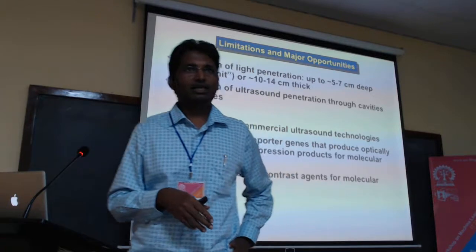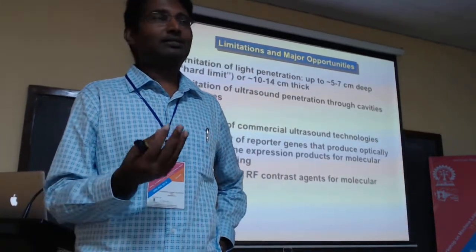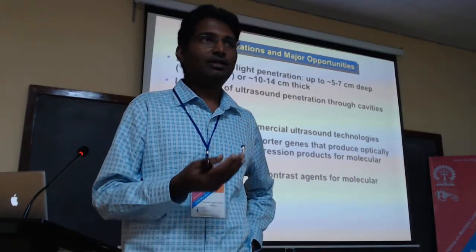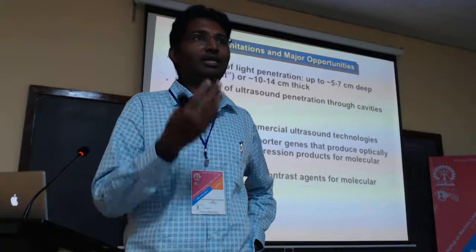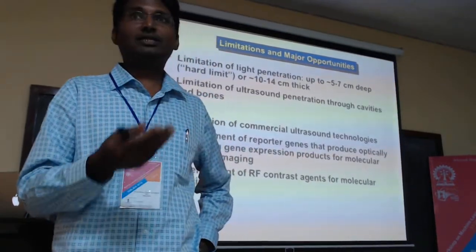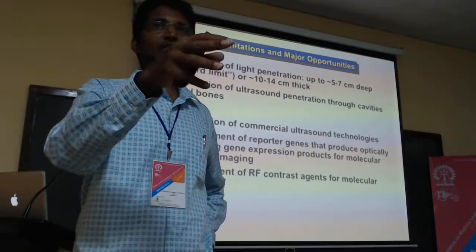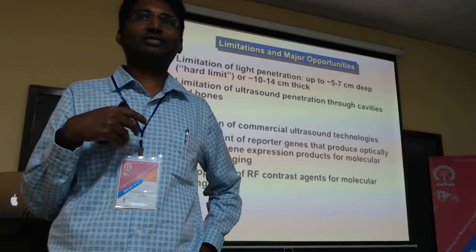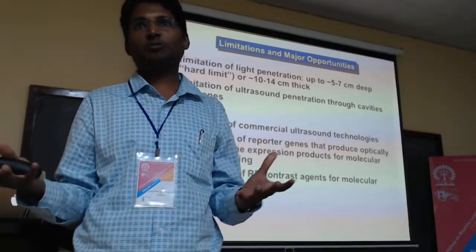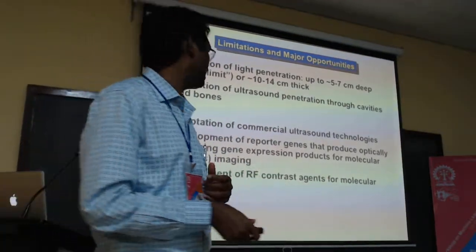So just in the earlier talk, we were talking about almost 10,000 frames per second. Imagine how fast you can image the blood flow. It opens up new possibilities for what you can image. That means I can really look at how the pulsation is going to be. But that kind of thing getting integrated into photoacoustic setups is not really happening that much. Still, it is very specialized equipment which people design. It's not that all the commercial ones are getting translated into this.